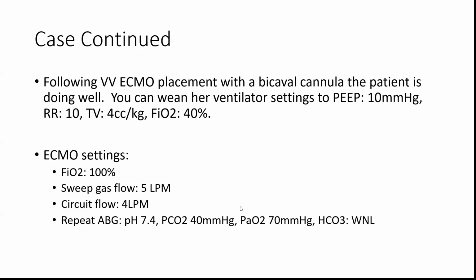Yeah. And the rest settings, so if you go to any ECMO course, well, not any, some of them will say 10 PEEP, 10 respiratory rate. There's no studies done to show what the ideal rest settings are for a patient. So if you want to go a little bit lower, no one will fault you.